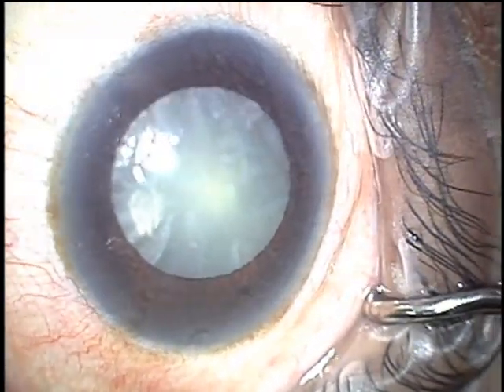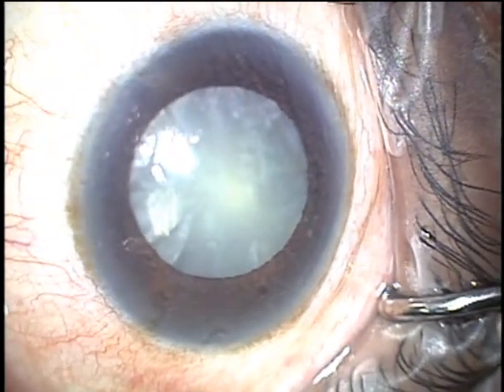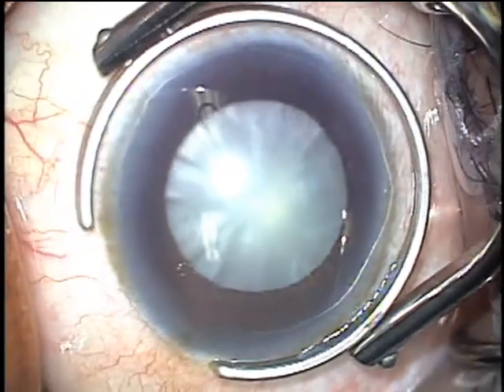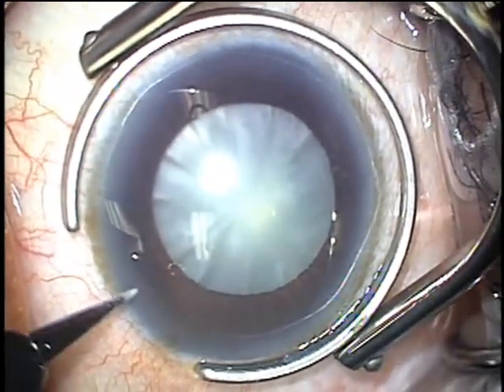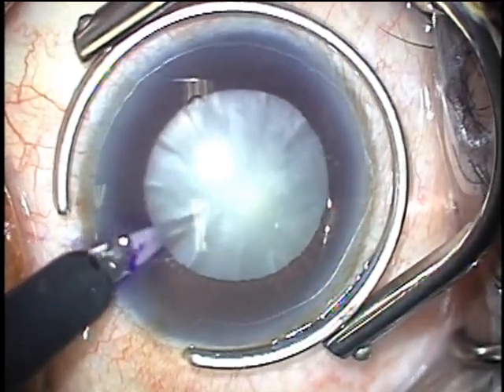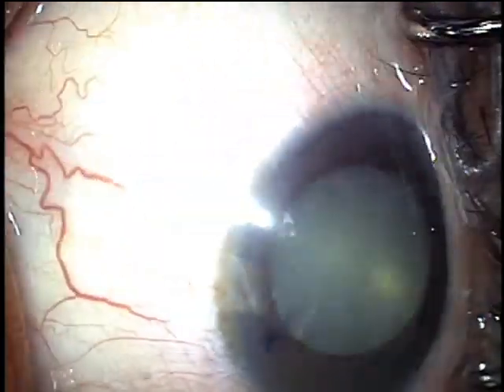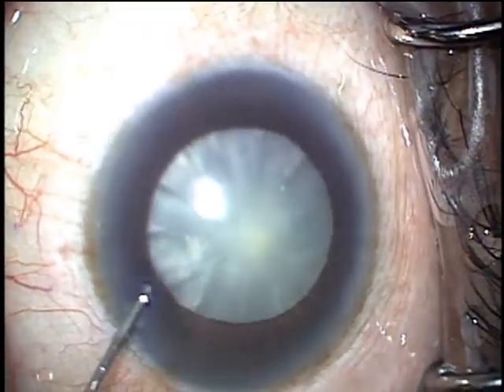Hello, this is Dr. Walter Harris and I'd like to show you my technique for decompressing a potentially intumescent white cataract. I use the FACO tip to decompress rather than the more traditional technique of using needle aspiration. I find this technique to be relatively easy, straightforward, safe, and efficient.